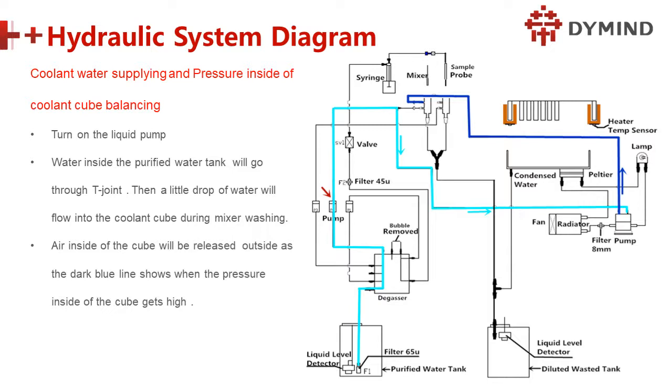So this is the same pump. Okay, same pump. Pumping the water into this place, and then to here, and then drainage. So there are two functions: supplying the water and also balancing the pressure inside. Right.